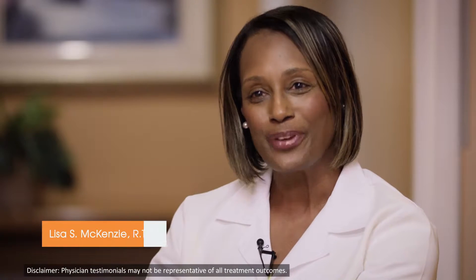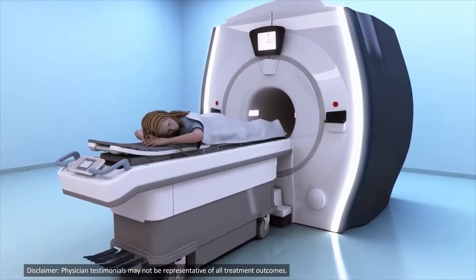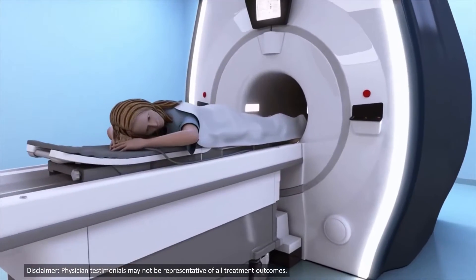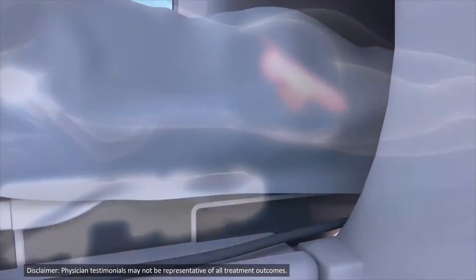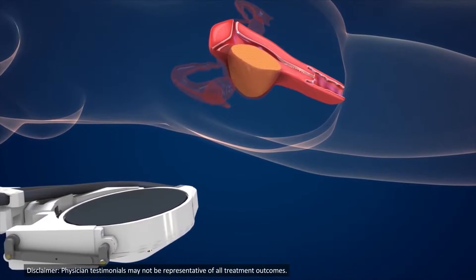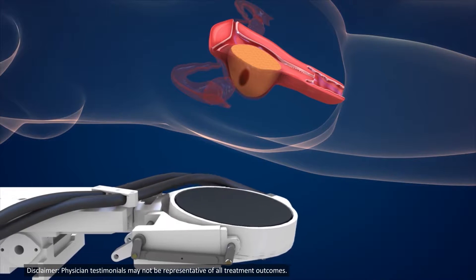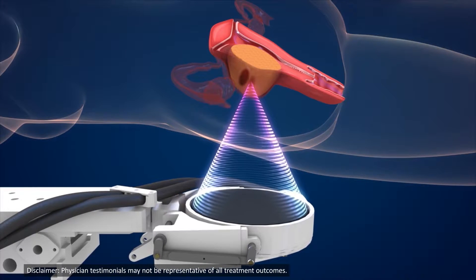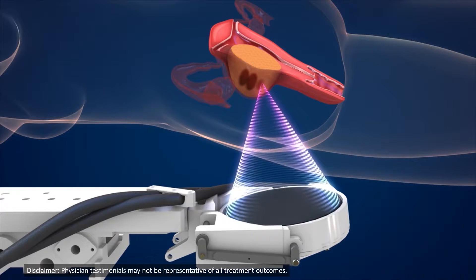The CuraWave experience is often quite comfortable for most patients. You walk into the facility, get prepared for your exam, and are brought into the examination room and positioned. You're on your belly for the entire procedure, which generally lasts an average of about three hours. Occasionally there is some heating and/or some cramping, but there's a nurse in the room with you at all times to help you through that process, and there is some light medication that can be administered.